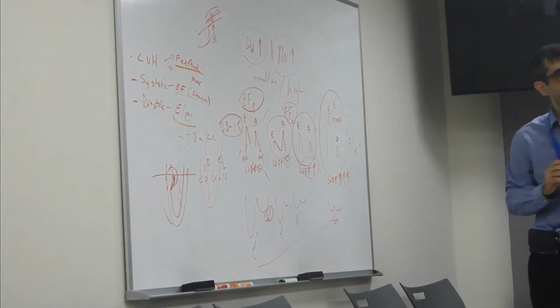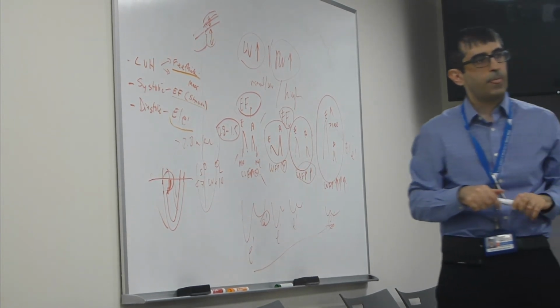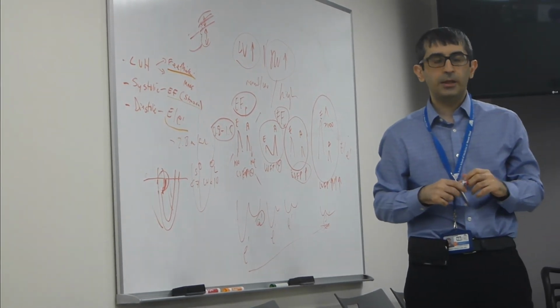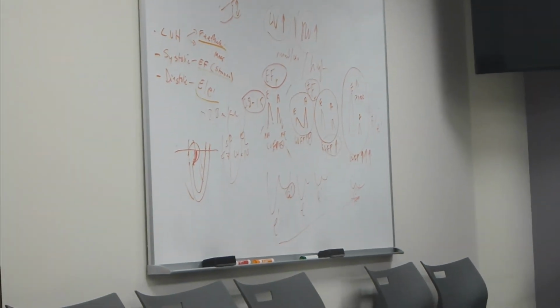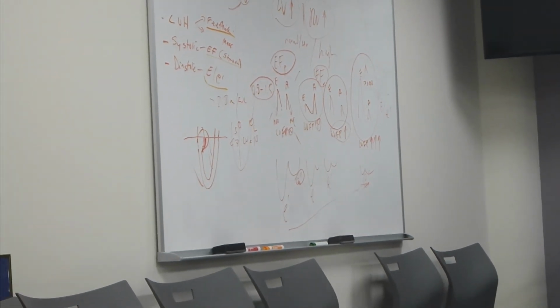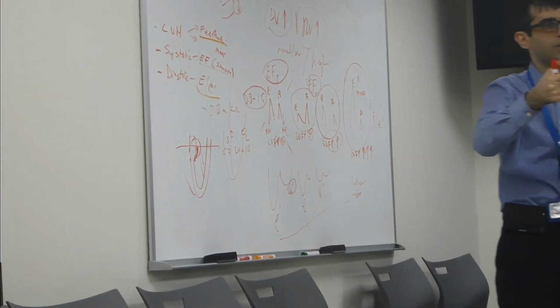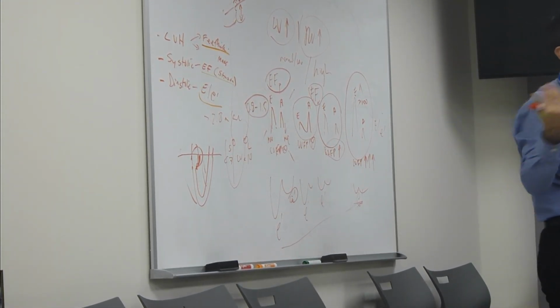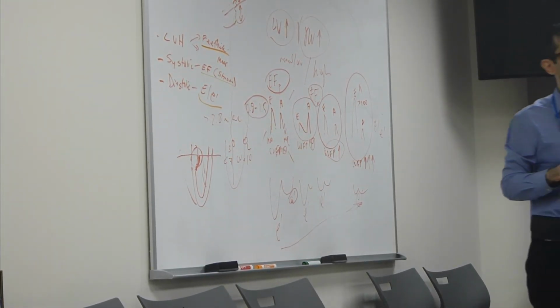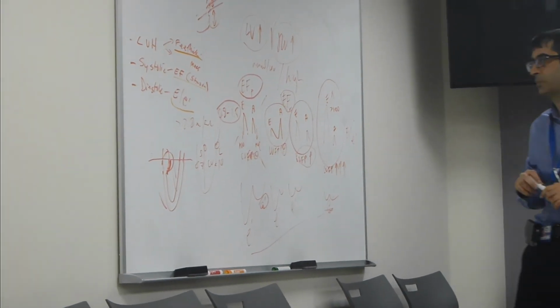Is it a strict cutoff measurement for LVH? Yes, in the guidelines, 1.1 centimeters, or 11 millimeters, is the cutoff for normal. Once you exceed that, it's considered LVH. And that's during diastole. Yes, that's diastole, absolutely.